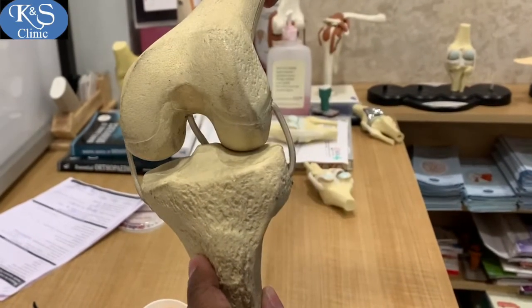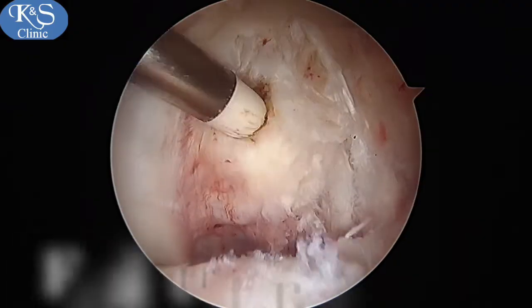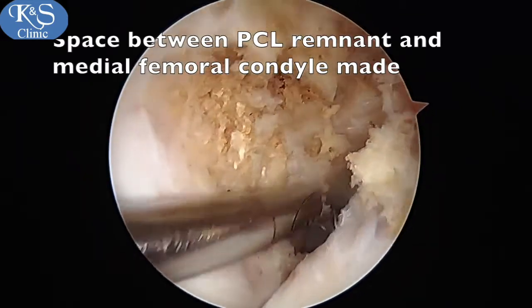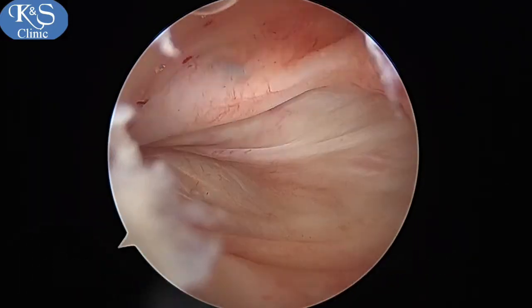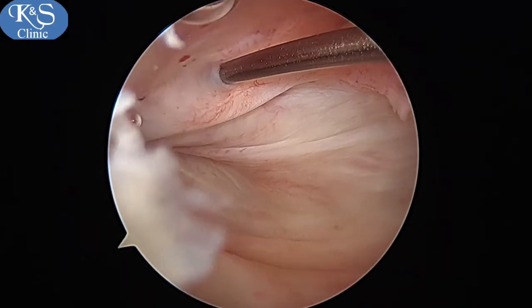A space is made between the PCL and the remnant to go to the back of the knee. A high posteromedial portal is then made via LP needle guidance, and a vertical portal is usually made.